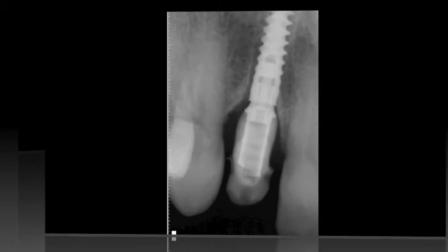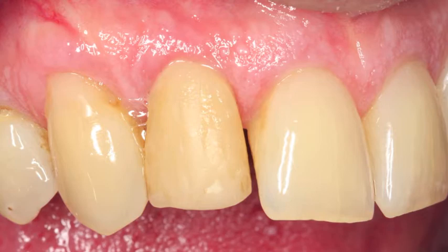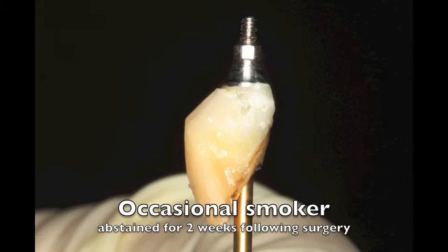So a 3.5 by 15 millimeter long Noble Active implant was placed. Then the tooth was temporized immediately, and you can see there was a little gap in the mesial aspect but the patient did very well after three months. So this is at three months healing. You can see that the bone is doing quite well. The patient did smoke during that period but didn't smoke for the first two weeks.